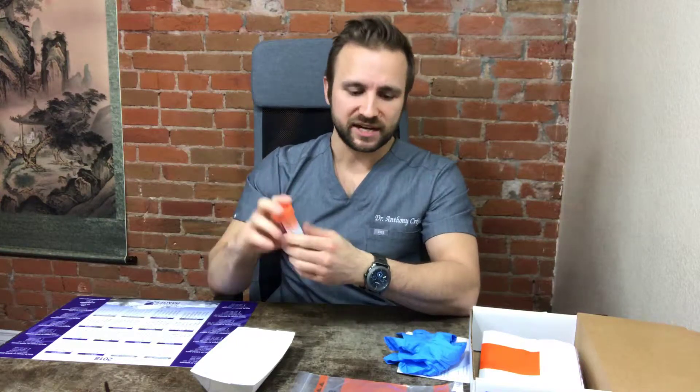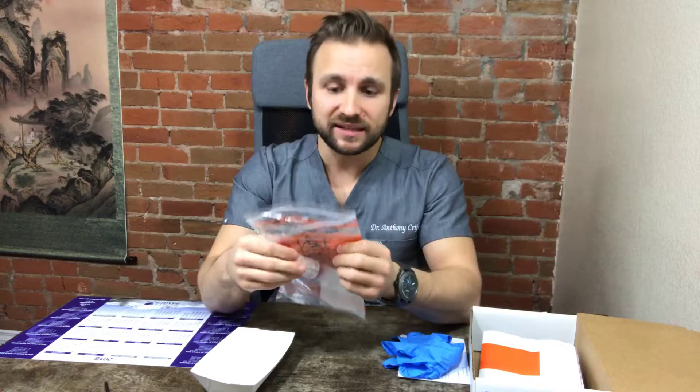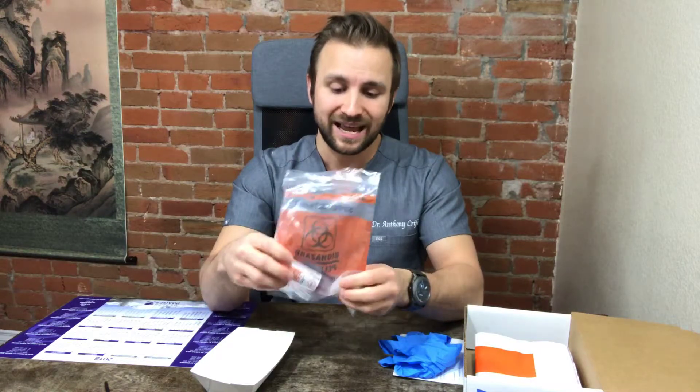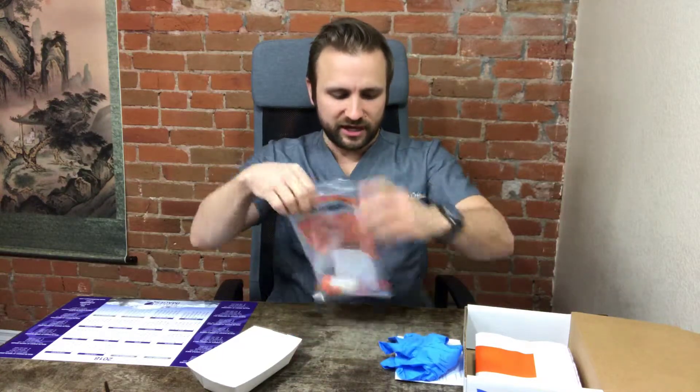Once you've done that and shaken it for 30 seconds, put the vial back into the bag with the absorbent pad. If you're shipping it that day, you can put it right inside the FedEx bag and ship it. If you're shipping it the next day, I recommend putting it in the refrigerator first. When ready, put the gloves away, fold up the requisition form, and place everything inside the FedEx bag.